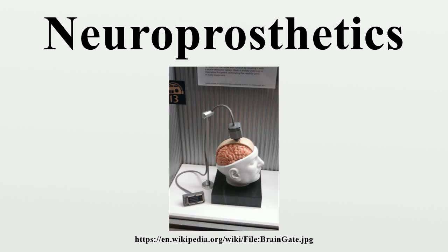Since the early 2000s, the FDA has been involved in a clinical trial of a device termed the Hybrid by Cochlear Corporation. This trial is aimed at examining the usefulness of cochlear implantation in patients with residual low-frequency hearing. The hybrid utilizes a shorter electrode than the standard cochlear implant. Since the electrode is shorter, it stimulates the basal region of the cochlea and hence the high-frequency tonotopic region. In theory, these devices would benefit patients with significant low-frequency residual hearing who have lost perception in the speech frequency range, and hence have decreased discrimination scores.